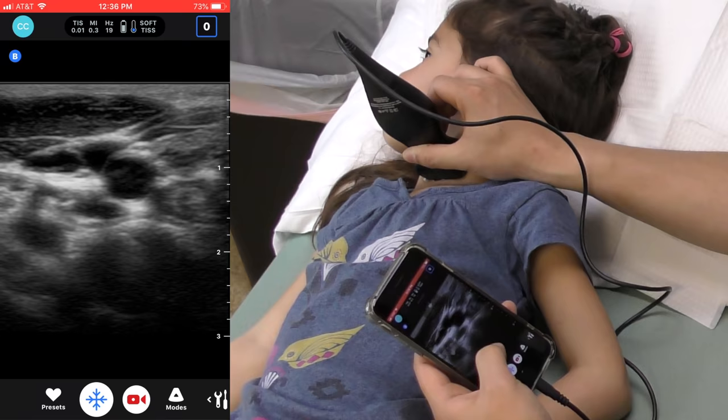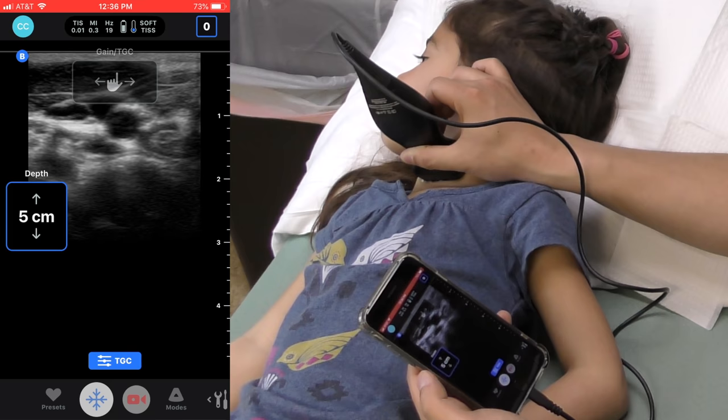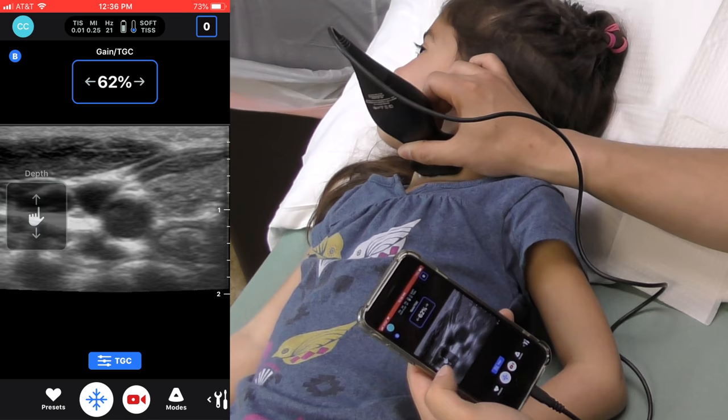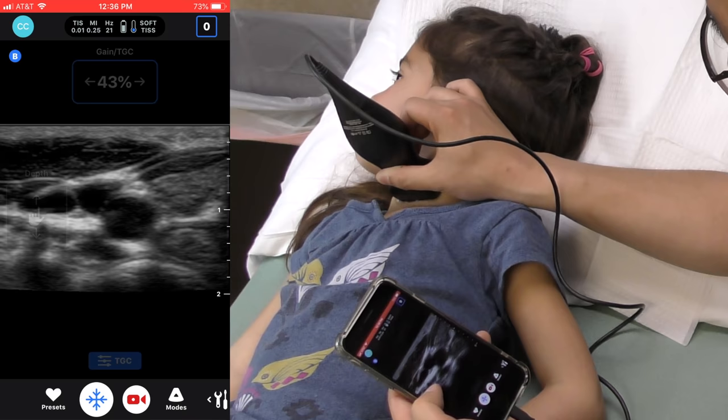The ultrasound image depth can be adjusted by swiping up and down. The ultrasound gain can be adjusted by swiping side to side. Double tapping can quickly zoom into and out of the image.